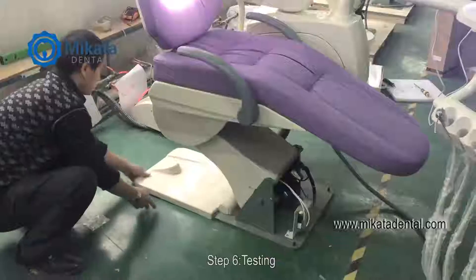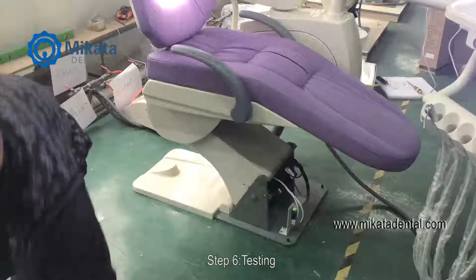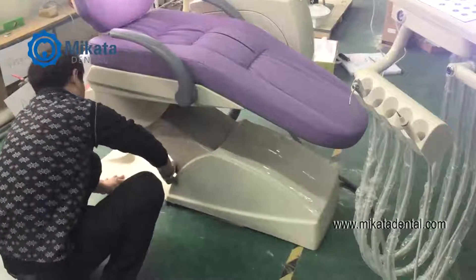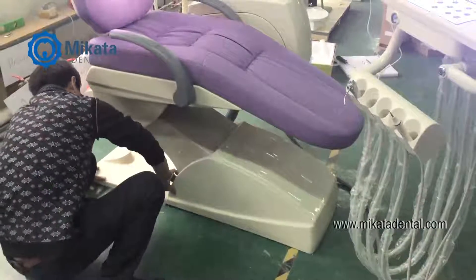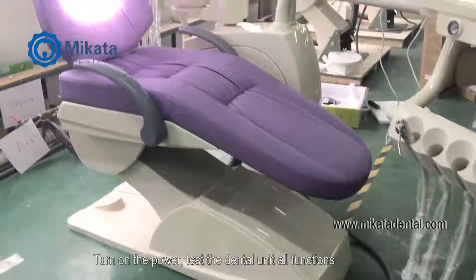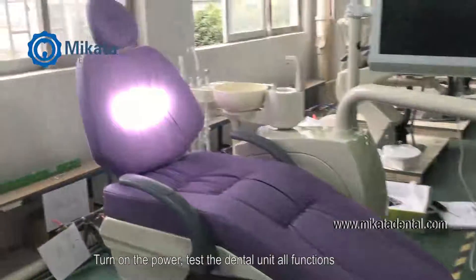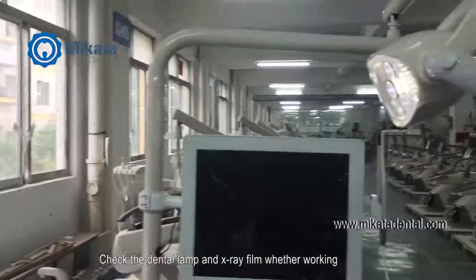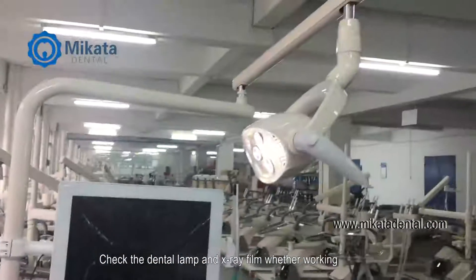Step 6. Testing. Turn on the power. Test the dental unit and all functions. Check the dental lamp and X-ray film viewer while working.